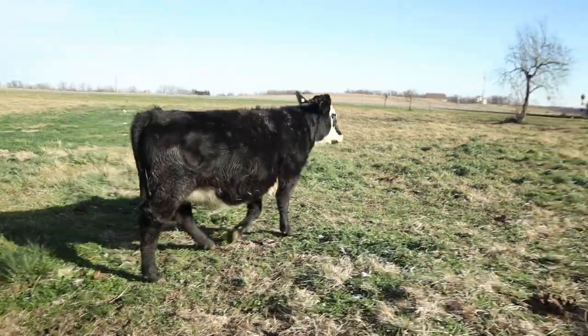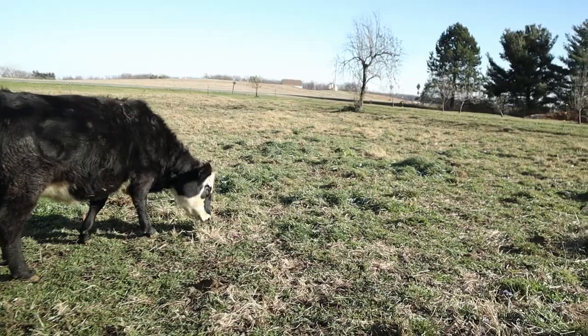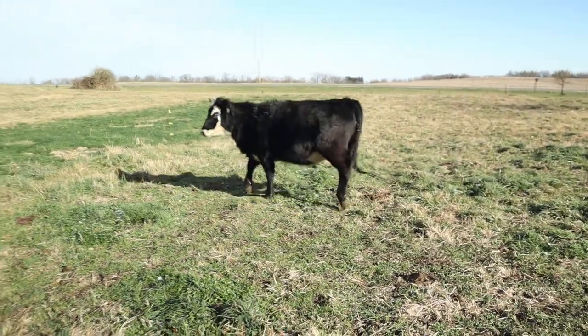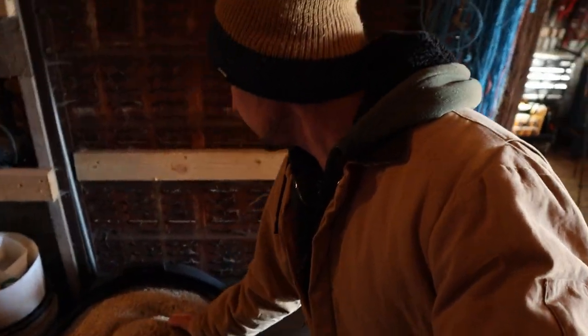Another thing to factor in is that this little heifer right here has also been going into heat, and that kind of messes with things. I think the best thing to do is just take the blood sample and test it and see what we can come up with. I'm going to get a little grain for her so she'll hold still.